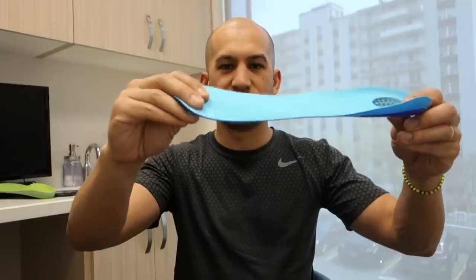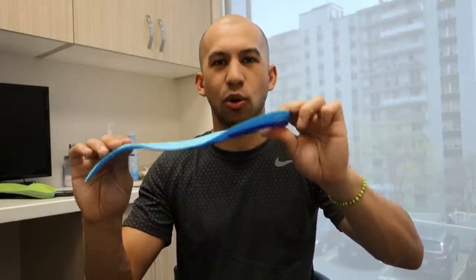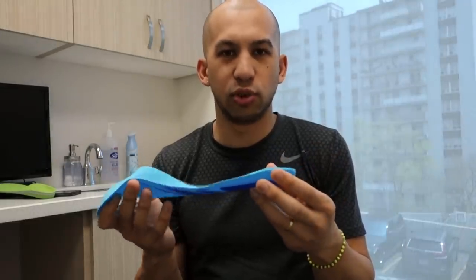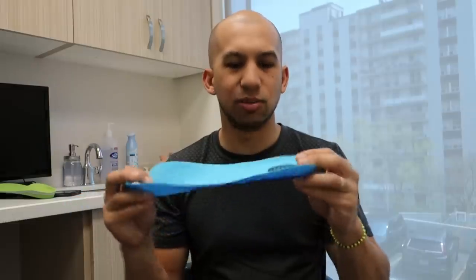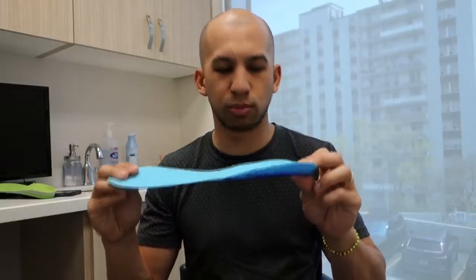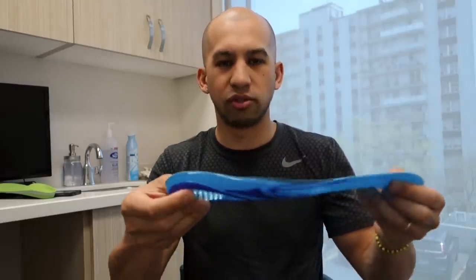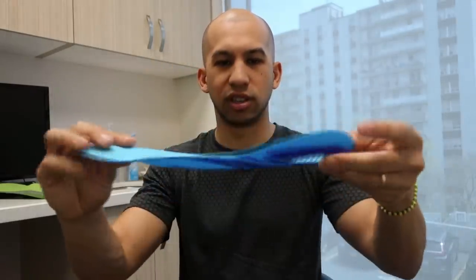We can see it's very thin at the front and much thicker underneath the heel, so this is mostly made for heel pain or heel discomfort because it will cushion the heel. This is something I tell a lot of people to use if they're doing a lot of walking and not really having foot discomfort but want to make the shoes more comfortable. This to me is made for comfort — it's not going to support your foot. Based on the definition, there's nothing that's really going to align, support, or correct. This is purely cushioning and comfort.